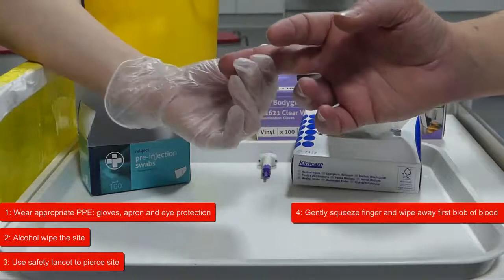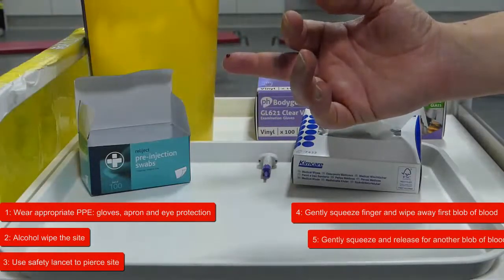Then wipe away the first blob of blood. Then squeeze and release to milk the site.